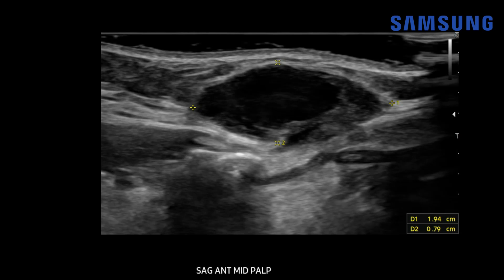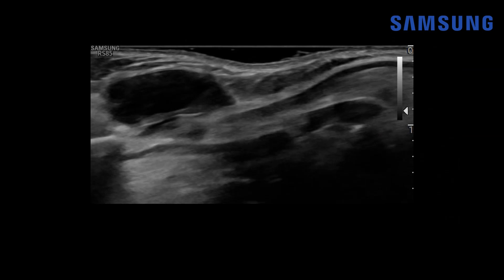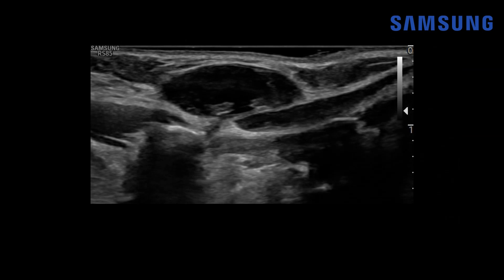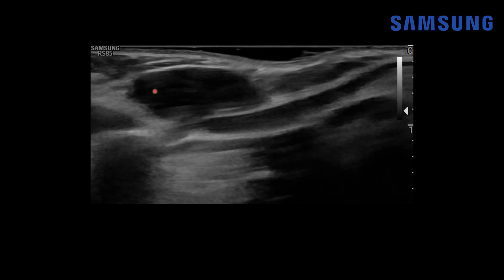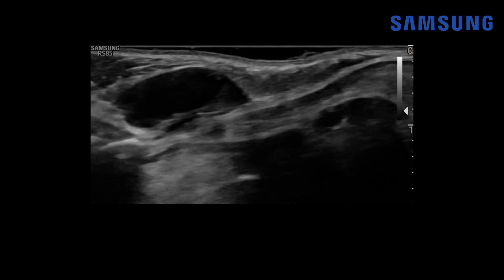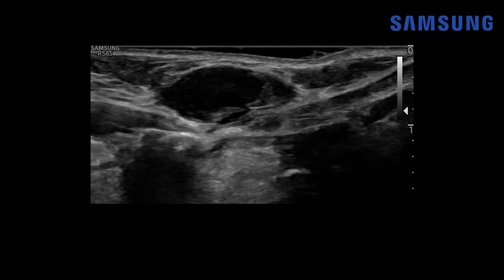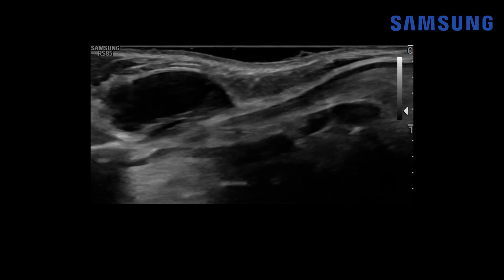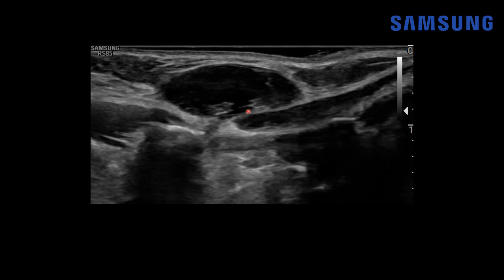Now we're looking at a sagittal view showing the ovoid thyroglossal duct cyst, and it does have some heterogeneous debris in it. When we add color Doppler, we don't see much flow in that area, but we do see some mild peripheral flow indicating inflammatory change. This is a sagittal cine clip — what dynamic maneuver are we asking the patient to do? Why is this cystic mass moving superiorly? We're having the patient stick their tongue out, and these classically will move superiorly following tongue movement. Because these occur along the thyroglossal duct, which goes from the foramen cecum of the tongue to the thyroid gland, there's the underlying hyoid bone and then the thyroid cartilage with the overlying strap musculature that this is partially embedded in.